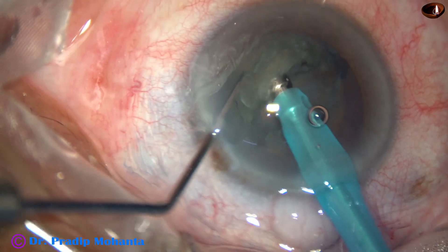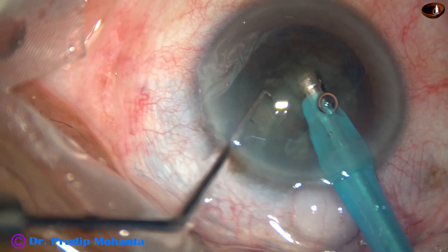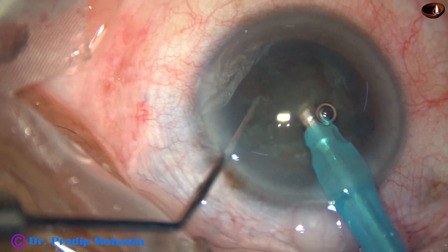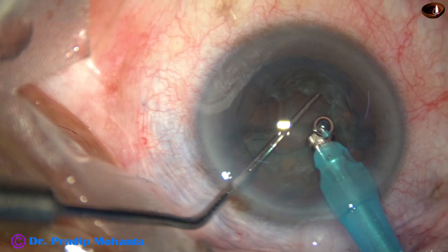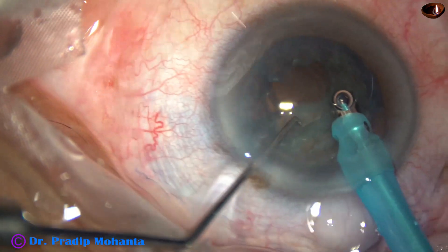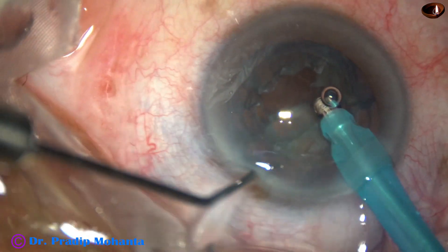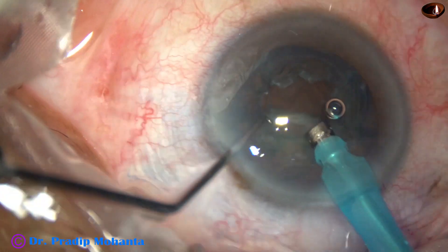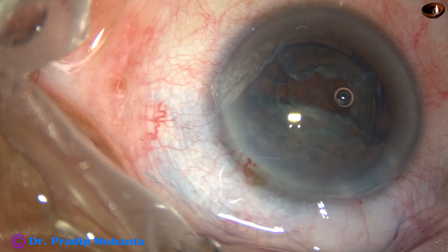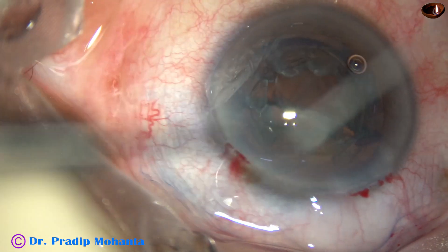The nucleus has been divided into two hemi-nuclei. Each hemi-nucleus is now being chopped with higher vacuum and the pieces are emulsified. Sculpting is done with low vacuum and low flow rate, and chopping and emulsification is carried out with higher vacuum and higher flow rate.